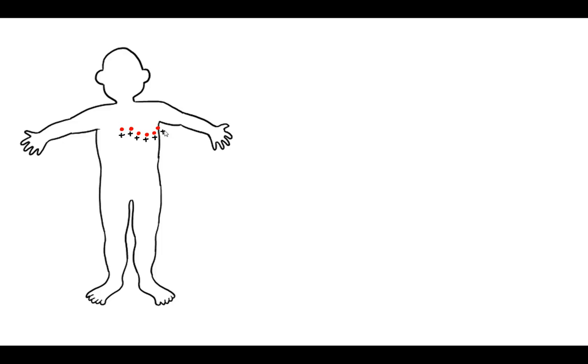So to kind of show you what I mean in 3D, I'm going to do a little bit of an animation. So let's say you cut the patient like so with the dashed line, and you get rid of the top part. So now you're looking at a cross section. I know that's a bit gory, but just bear with it for a bit. So if we were to draw in what you would see in the cross section, you would kind of also draw a slice through the heart.